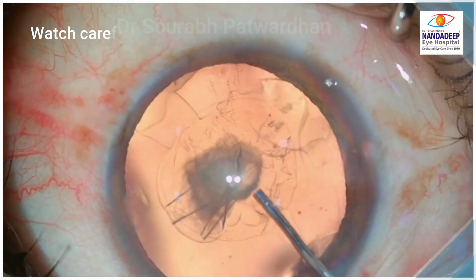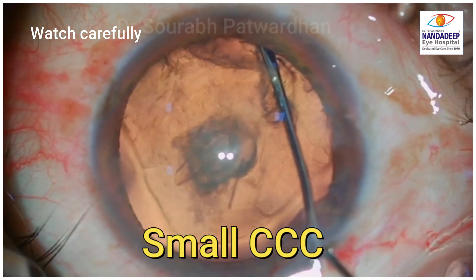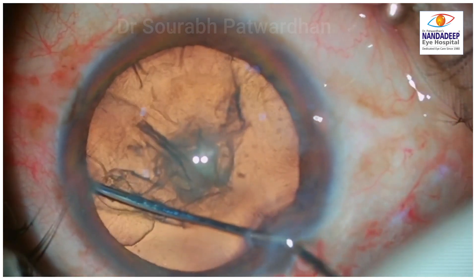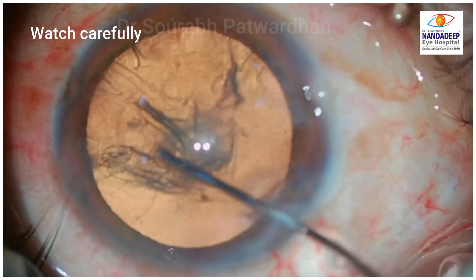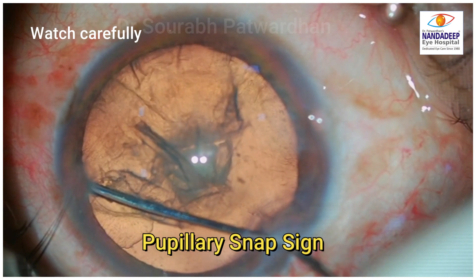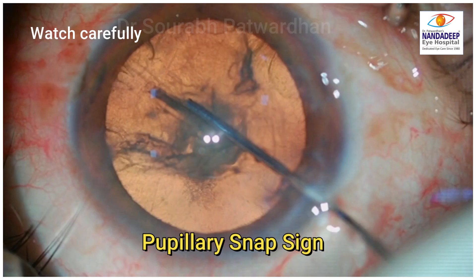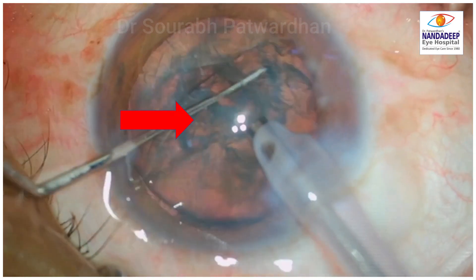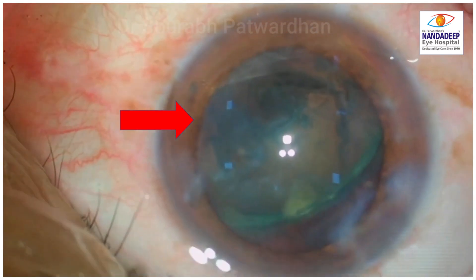In case number 2, you can see that the surgeon has started with a very small capsulorrhexis. The first wave passes, the nucleus is stabbed but may not be adequate, and then tries to have another hydrodissection wave. Watch what happens — the fluid ruptures the posterior capsule, and at the same time you see the pupillary snap sign. The pupil constricts momentarily and there is deepening of the anterior chamber.